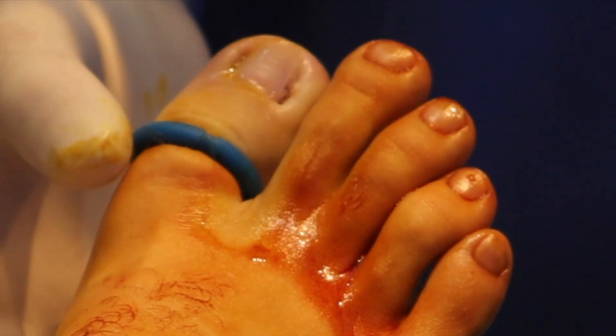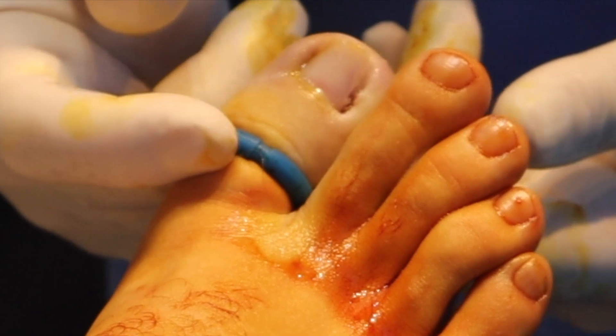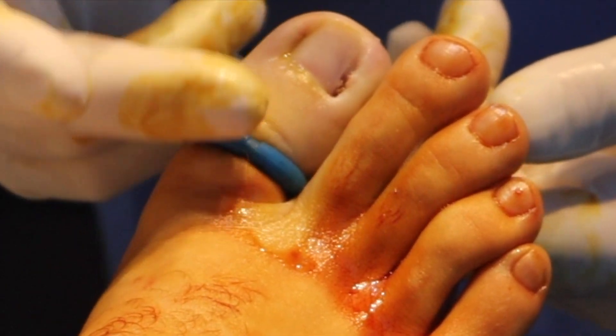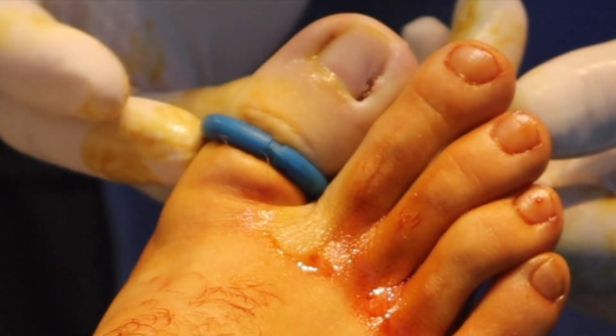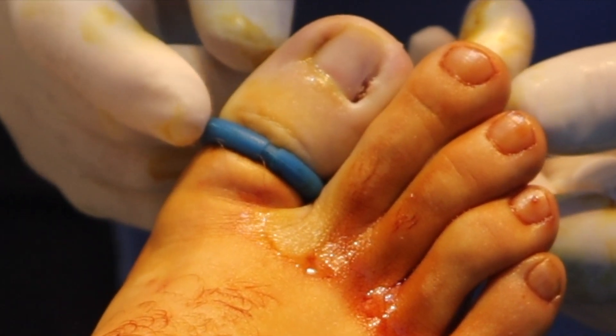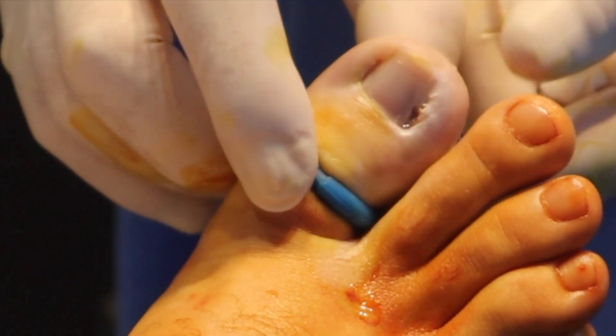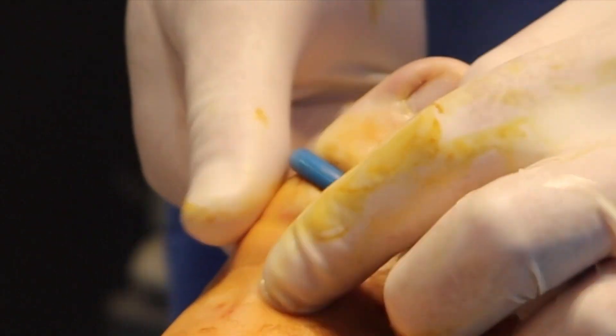Always remember the most important thing with this procedure: remove the tourniquet. Whatever way you use to place the tourniquet on, make sure you remove it before that bandage goes on. So the first thing we're going to do — very important — is remove the tourniquet.